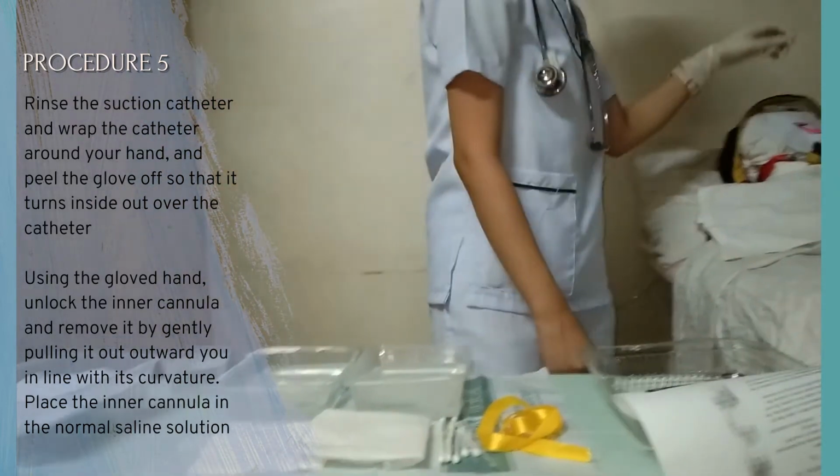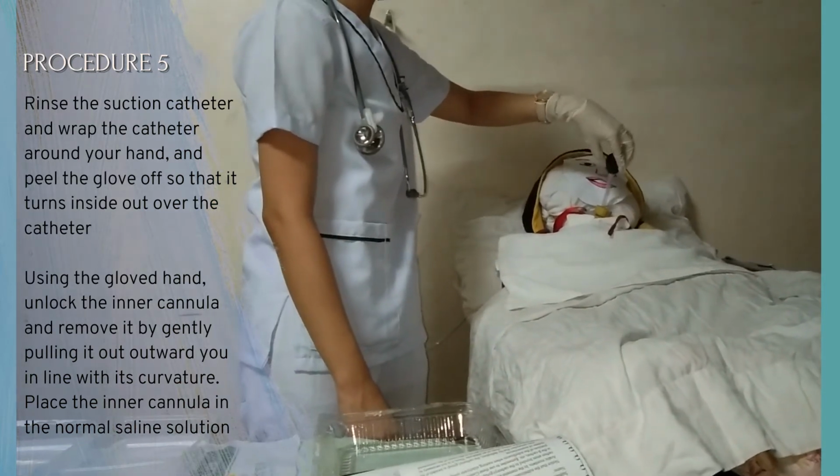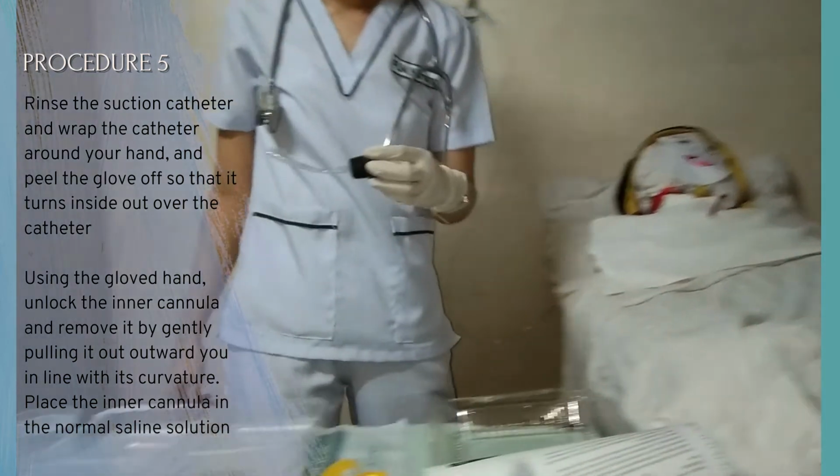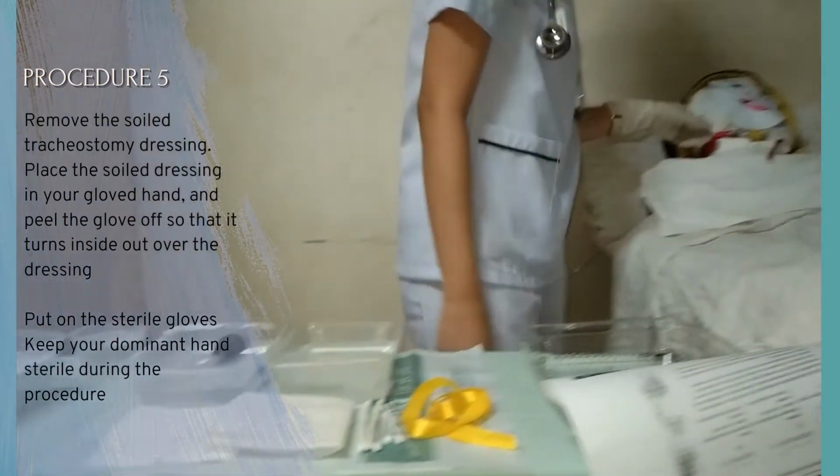Using the gloved hand, unlock the inner cannula and remove it by gently pulling it out toward you in line with its curvature. Place the inner cannula in the normal saline solution. This process moistens and loosens secretions from the inner cannula.